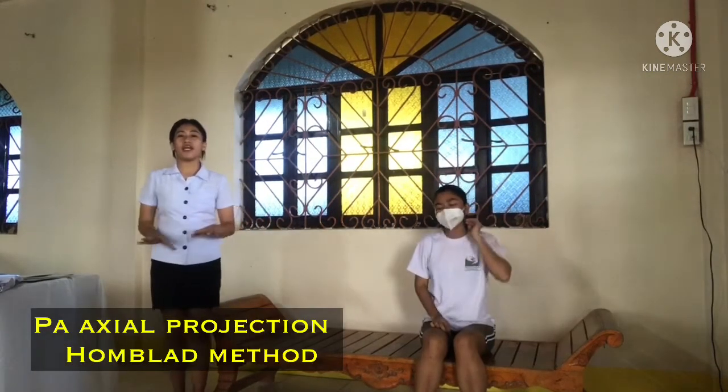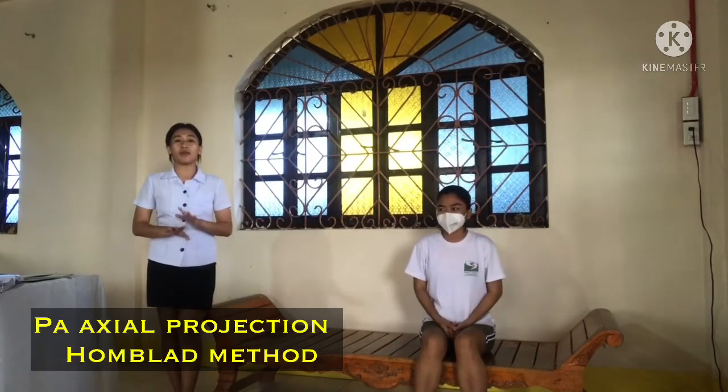Next, we have the PA axial projection, Holmblad method. So the IR used for this projection must be 8 by 10 inches. So let the patient kneel on the radiographic table as originally described by Holmblad with the affected knee over the IR.